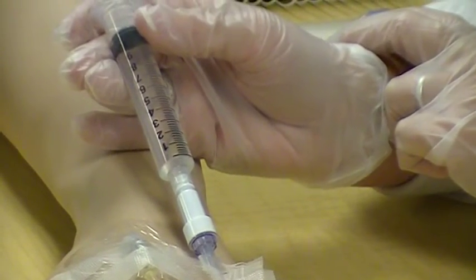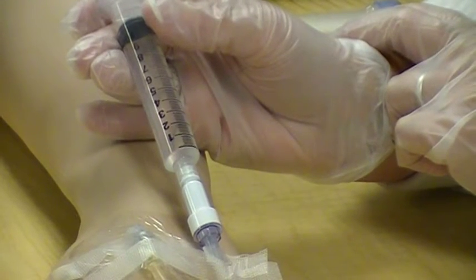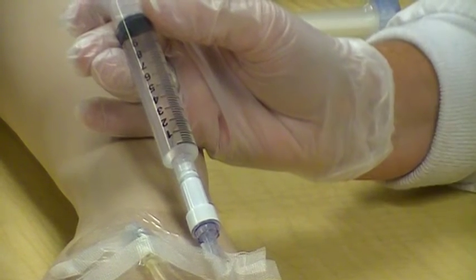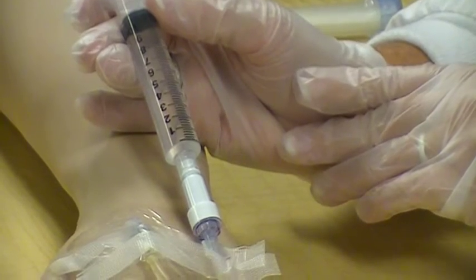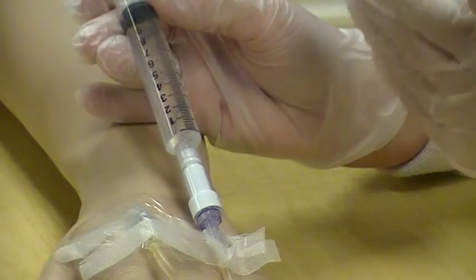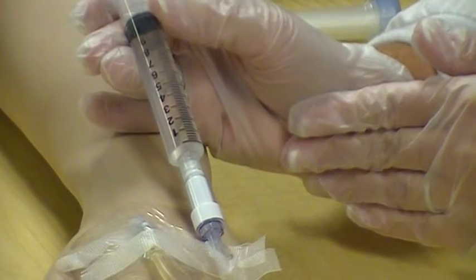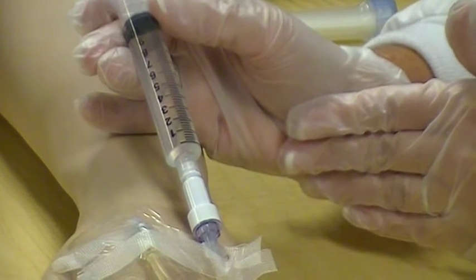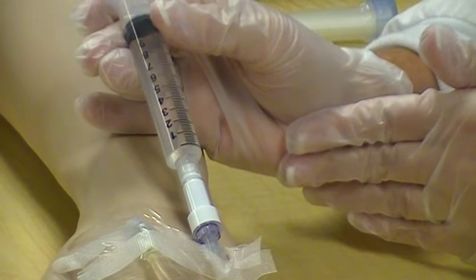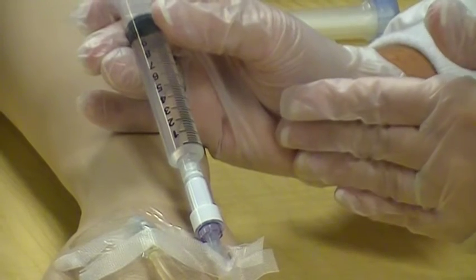Your lab book says to flush with 1 to 5 milliliters of normal saline over 1 to 5 minutes. Depending on your facility, you may push 1, you may push 5, so you need to know your facility's policy. What is their policy on flushing with saline? How much is appropriate? Just for demonstration and time purposes, we're going to push 1 milliliter. The rule for pushing normal saline is 1 milliliter per 1 minute. Therefore, if your facility says to push 5 milliliters, that would take you 5 minutes.